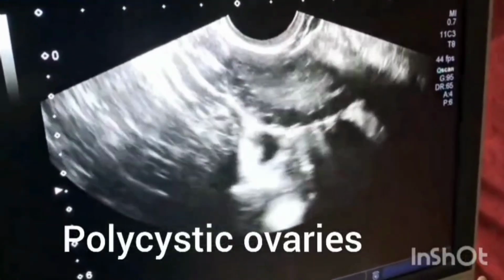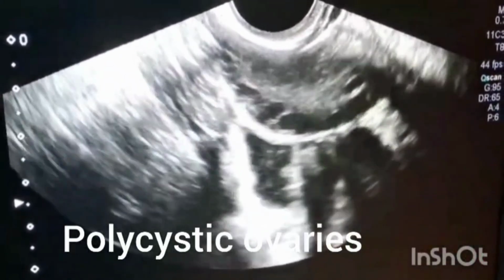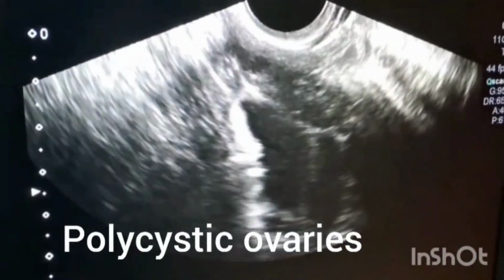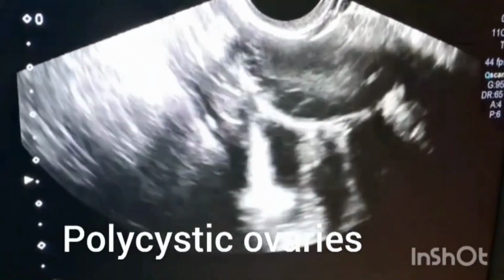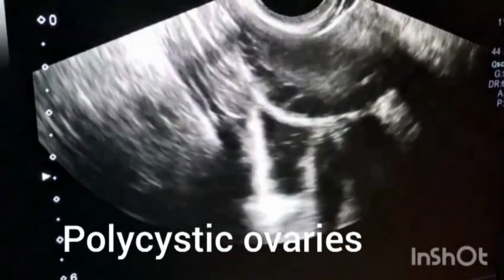Polycystic ovaries are characterized by increased volume of ovaries on both sides. It is almost always more than 10 ml. Normally it should be less than 10 ml.